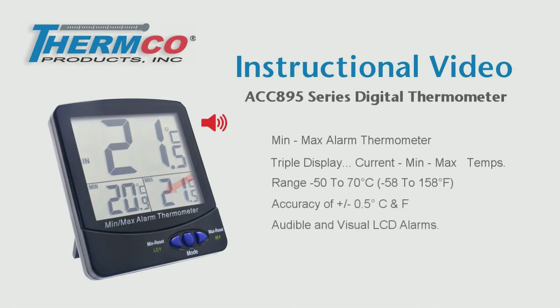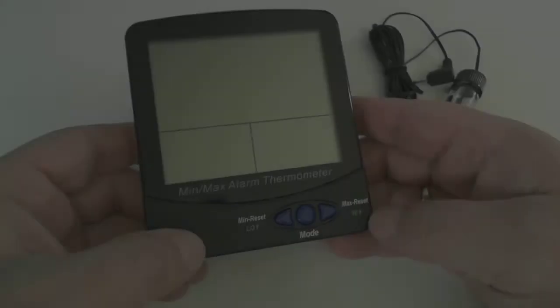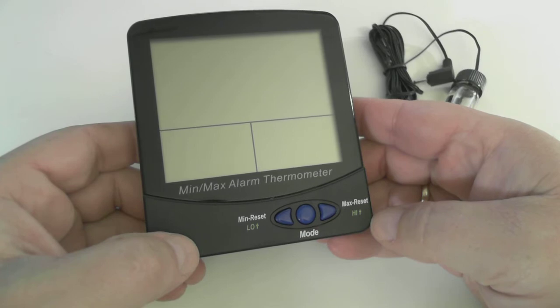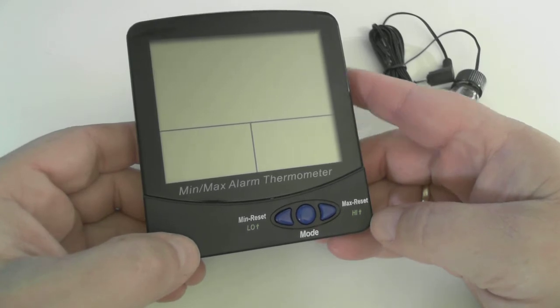This model has audible and visual LCD alarms with programmable low and high alarm set points. Let's do a quick overview of the ACC 895.